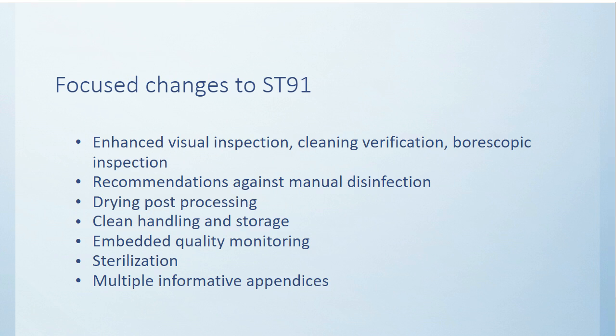We have more information around clean handling, wearing gloves, containerizing scopes, what to do in storage. We've embedded how to monitor quality throughout the document. Much expanded emphasis and section on sterilization, as this is where we see the future of endoscope processing, and have included many appendices or annexes which give you just information on the topic, such as inspection. We have a very informative pictorial annex on inspection, including internal borescope inspections.